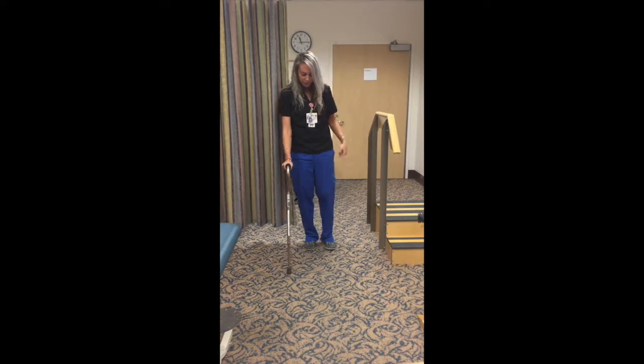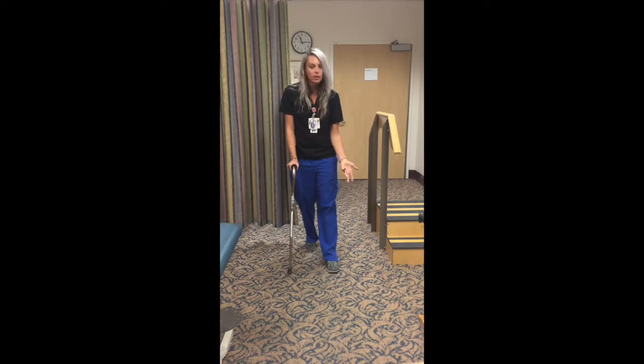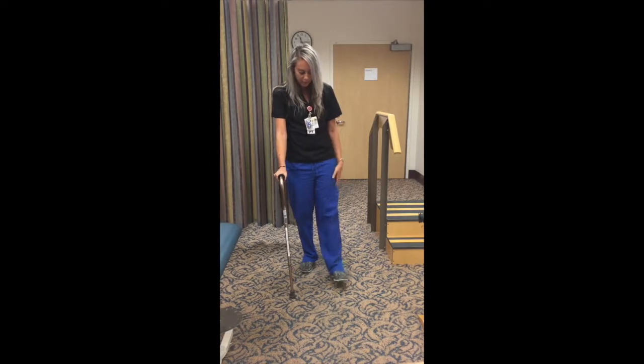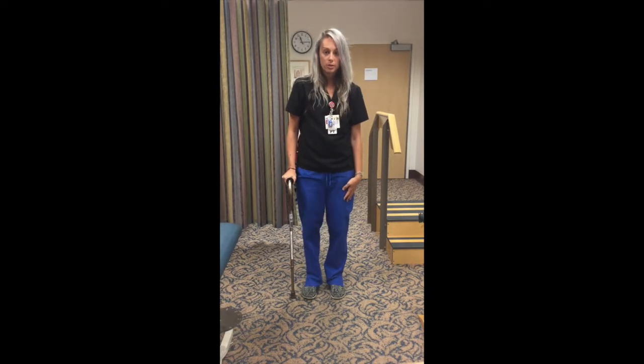So cane forward first, operated side, you're just matching the cane at this point, and then good side. Okay, cane forward first, operated side, and then good side.